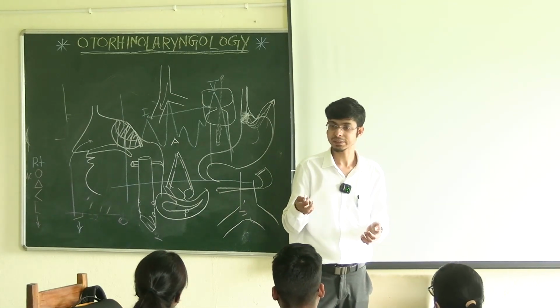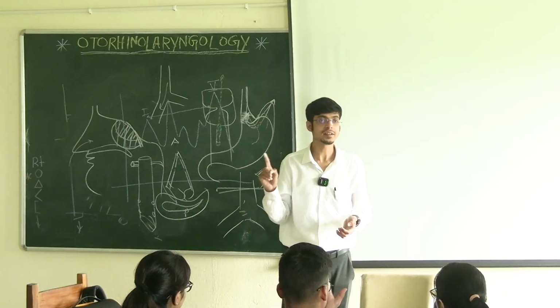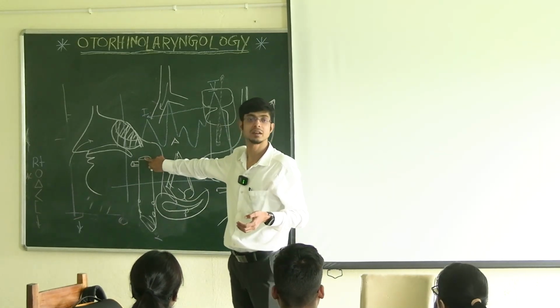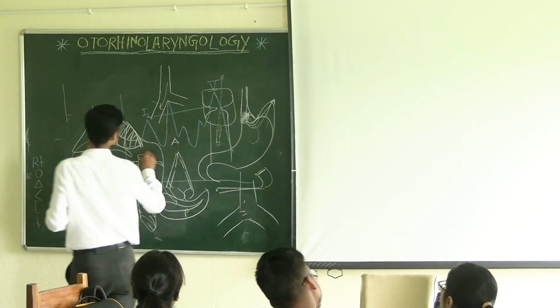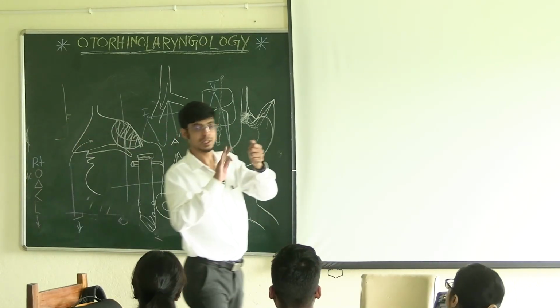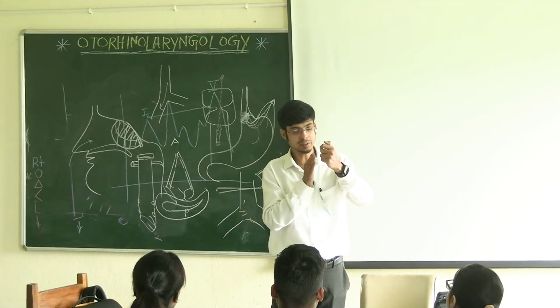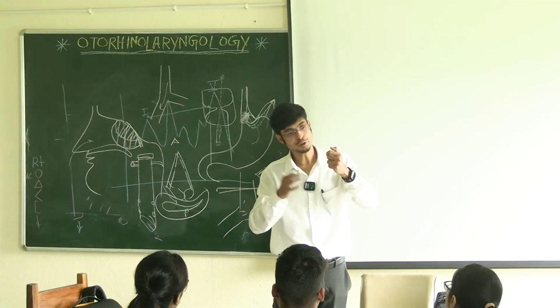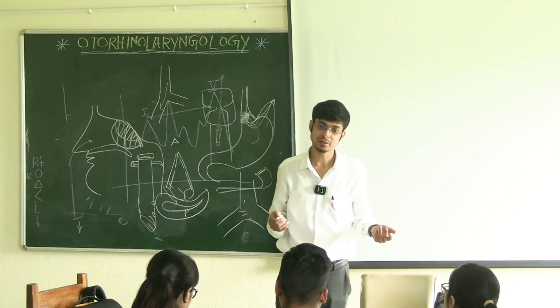The child will not be apneic. Okay. And usually, so you need a closed circuit, right, for ventilation. You need the circuit to be closed. So this side is open, right? So there is usually a glass cap. So when going in, we keep the cap there. You can see through the glass. When we reach the foreign body, we can locate it. Then we just remove the cap, use the instrument, take the foreign body out, put the cap in, continue ventilation, gradually take it out and then replace with the tube and gradually reverse the patient out.